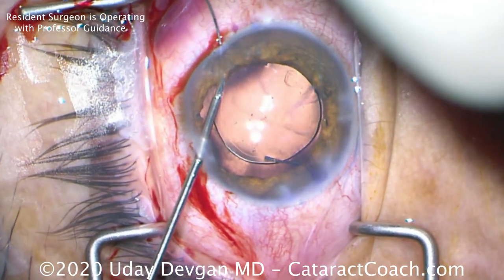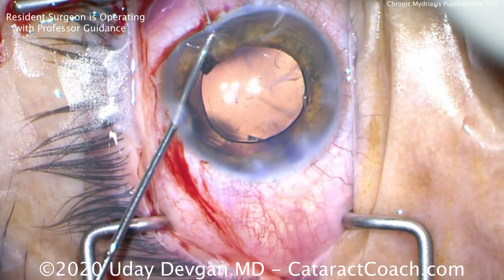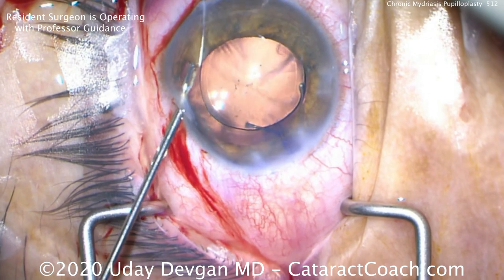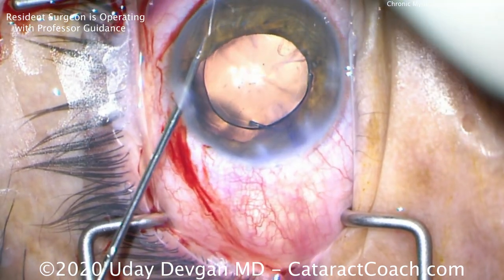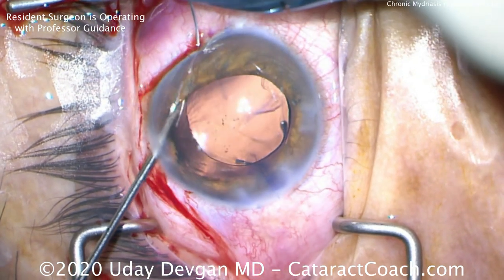We're using a 10-0 prolene on a CIF-4 needle, poking through the limbus, grabbing the iris with 23-gauge forceps, and pushing through. And there we've got our first bite.